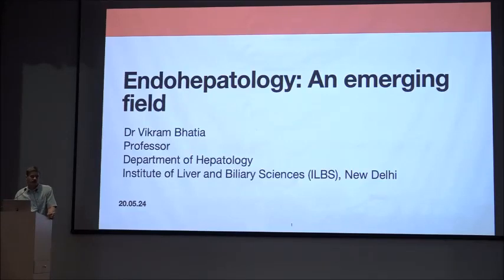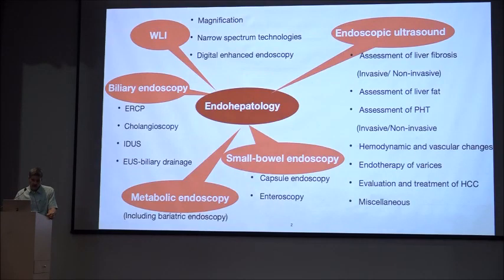I'll be talking on endohepatology today, and for the fellows, endohepatology should include a whole holistic view of how endoscopy is applied to hepatology, and this will include white light imaging. So with white light endoscopy, we will use magnification, narrow spectrum technology, and digital enhanced endoscopy to define the endoscopic manifestations of portal hypertension.